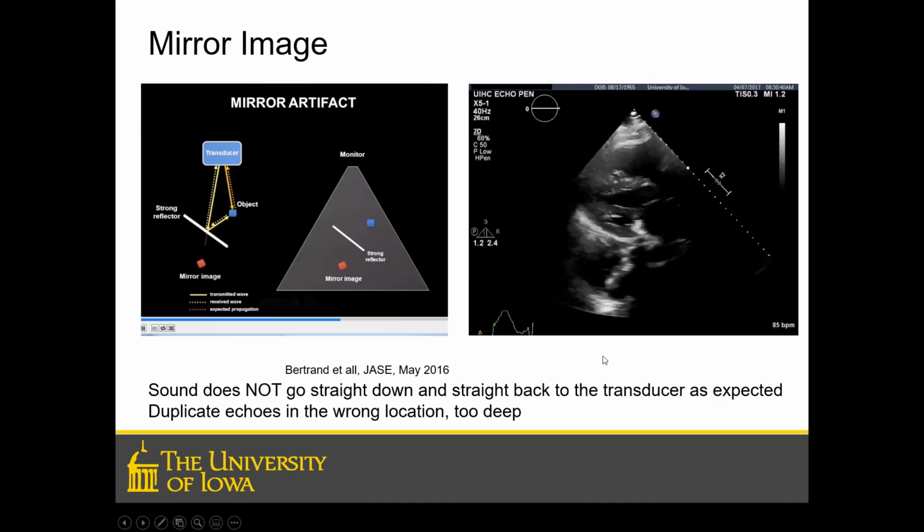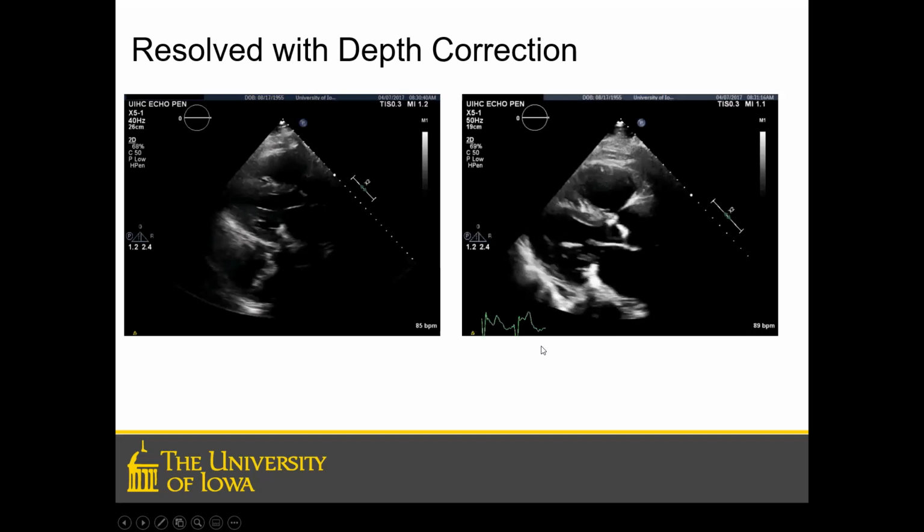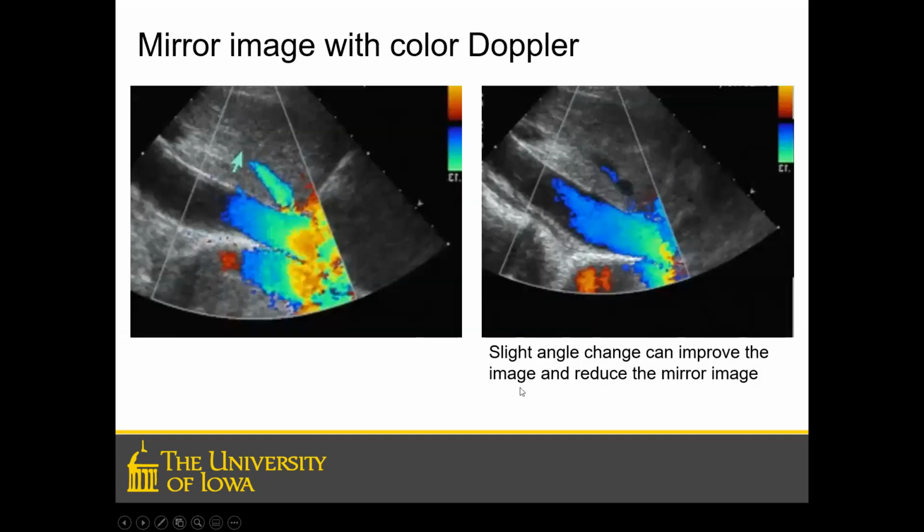If we're imaging quite deep, you can see it. And voila, if we decrease the depth, that artifact's still there, but you can't see it. Other than that, there's no real way to get rid of that artifact. It's going to just be there.